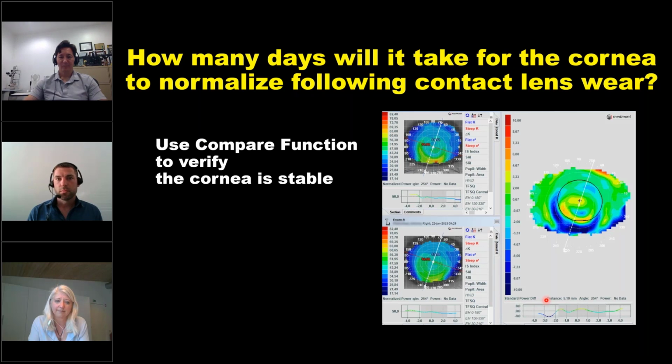That was also a very good point. Yeah, that was addressed during one of the sessions as well. I mean, here a plus 10 to minus 10 scale shows very obviously that there are changes this cornea is going through. But if it were small changes and not large like these ones, we would need a tighter scale. So it's a very good point, Nikki.